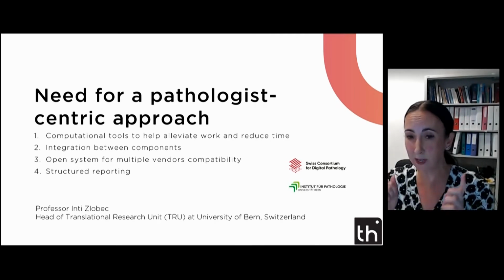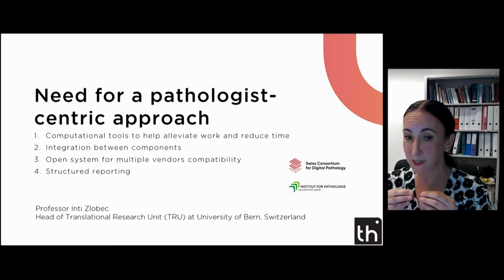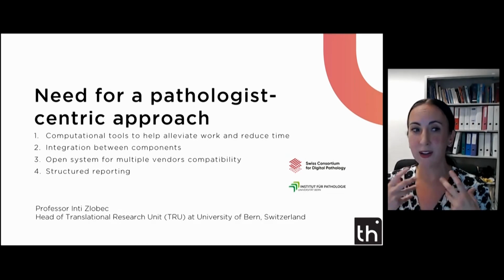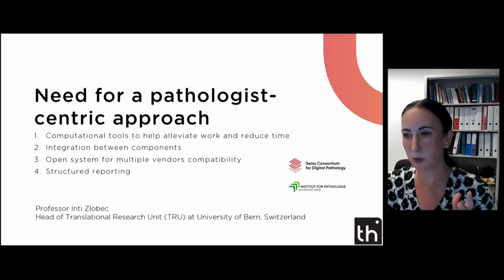It's something to never forget. How do you utilize the power of the research side and the diagnostic side and put these two things together? This is not so easy, and actually took a few years of experience from our side to figure out how to optimize this process and not get tricked into buying something that maybe doesn't even allow us to export our images.